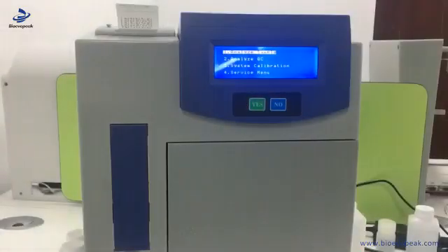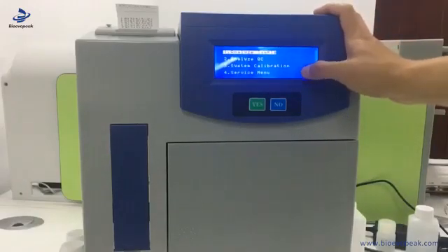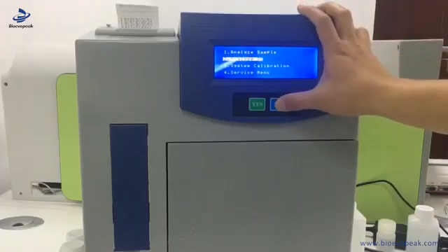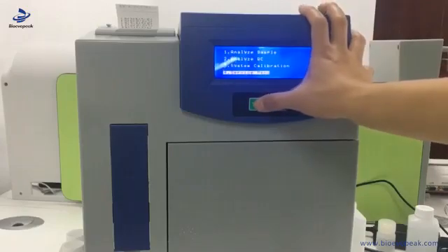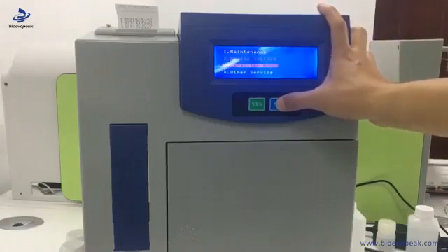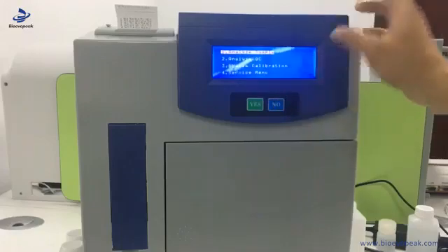Now we enter into the main menu. Every page has four options. We press no to select. If the one doesn't suit your need, you press no to select others. When you press yes, then you can go to the sub-menus. You can press no to select and press yes to go to the sub-menus.